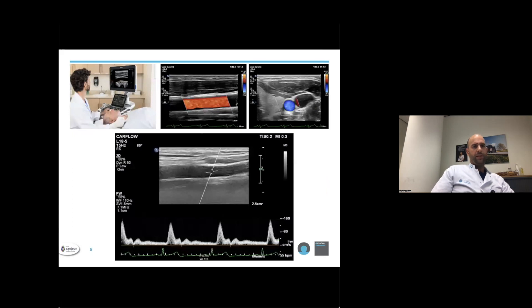Let's go back to our unaffected vessel, in which a pulse wave doppler sample can be placed at the center of the carotid artery, keeping the maximum angle between blood flow and the ultrasound beam below 60 degrees. From the pulse wave doppler velocity signal, we can differentiate between two types of indices: blood flow velocity on the y-axis and blood flow time on the x-axis.